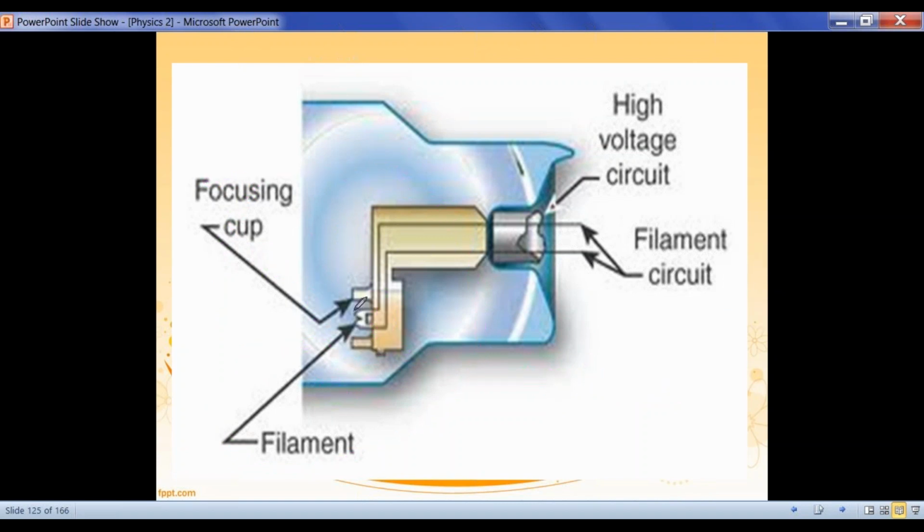So, ang purpose po niyan is pag yung mga electrons po ay nandito, when we apply high voltage, it will be accelerated papunta sa ating target. So, sama-sama po sila mapupunta sa ating target. Dahil marami po sila, sabay-sabay sila, magkakaroon din tayo ng maraming amount of X-rays or higher X-ray intensity or quantity of X-ray.